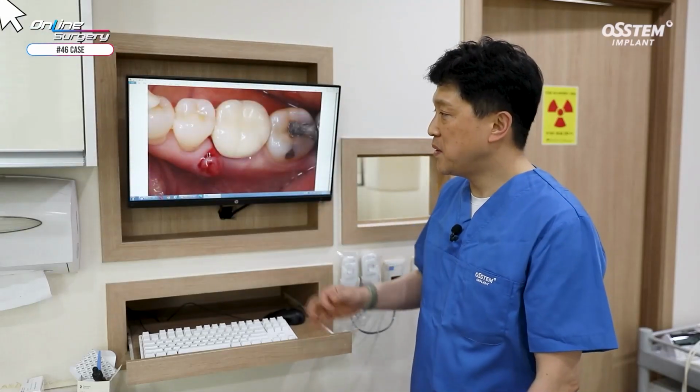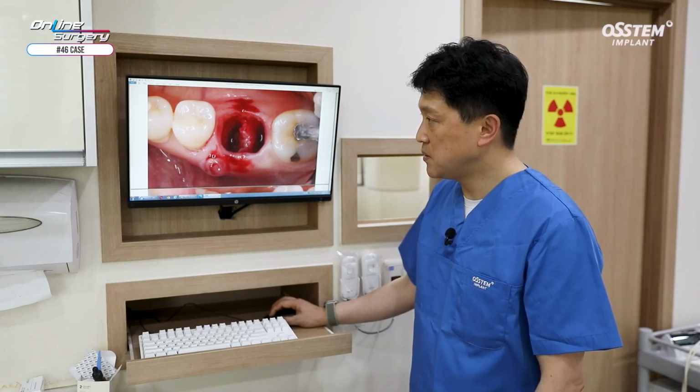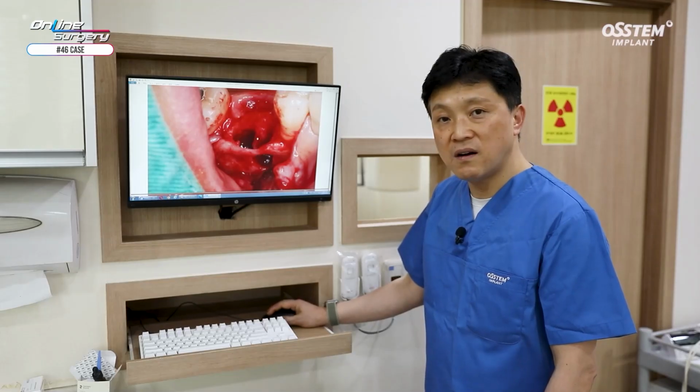That was the surgical clip. Let's review the case. You can see that on the mesial side, following the fistula tract, you can see fenestration defect as shown. You can see there's perforation and bone loss.